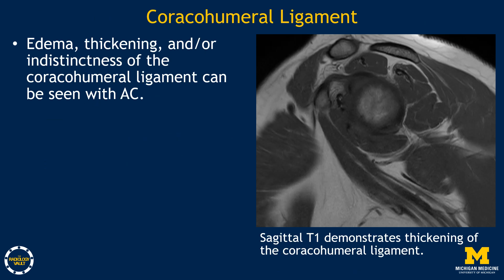The coracohumeral ligament is another region to investigate in shoulder MRI to assess for adhesive capsulitis. If you notice edema, thickening, and/or indistinctness of the coracohumeral ligament, this can also be seen with adhesive capsulitis. Here on the right-hand side, we have a sagittal T1 image demonstrating thickening of the coracohumeral ligament, as annotated by the arrow.